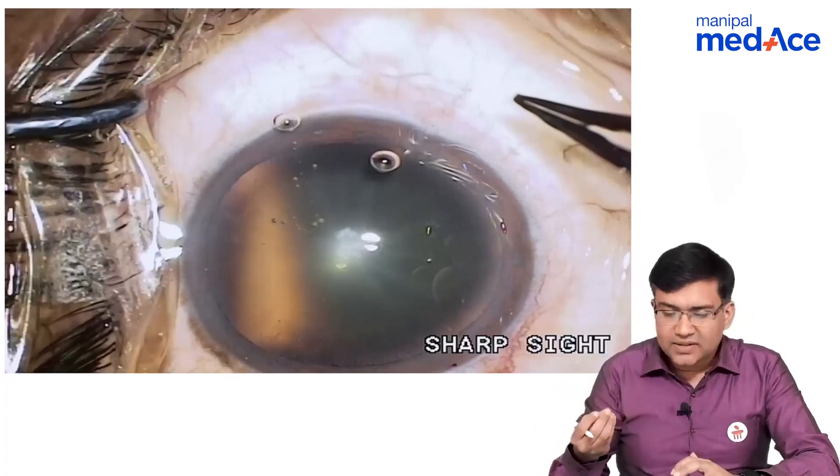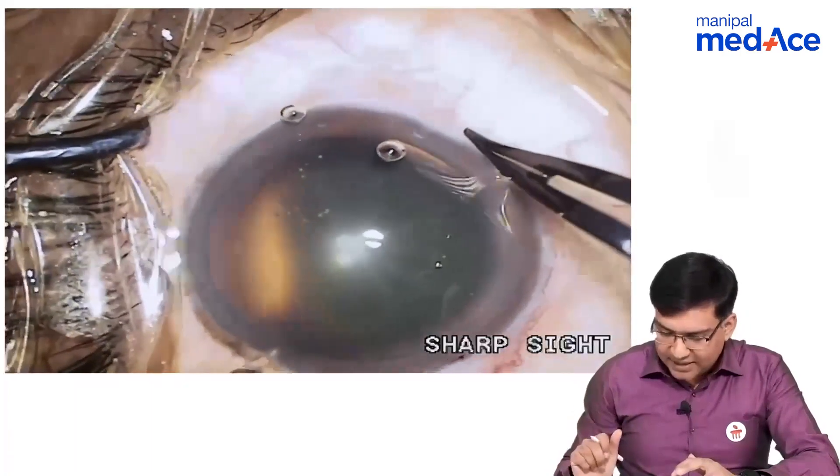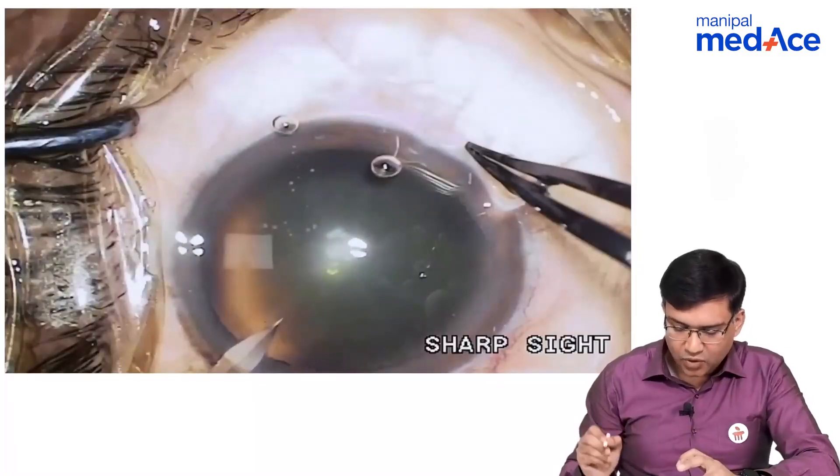First of all, what we do is we basically make a corneal incision. As you can see here, there is a corneal incision that is basically made here.